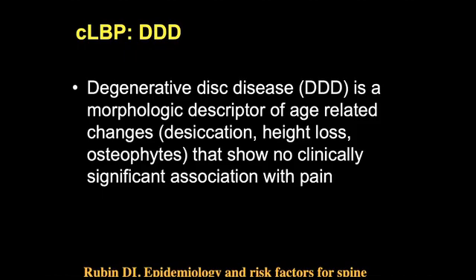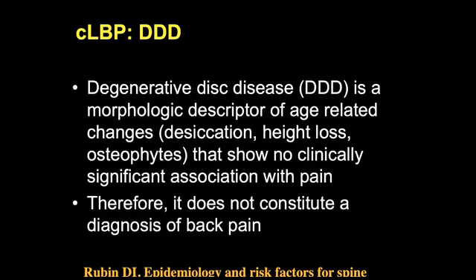So in terms of chronic low back pain, degenerative disc disease is a morphologic description of these age-related changes that shows no association with pain. And therefore, when you say somebody has degenerative disc disease, it doesn't constitute a diagnosis of back pain.